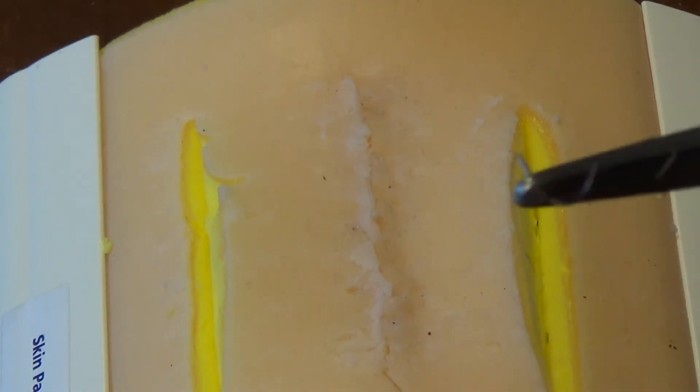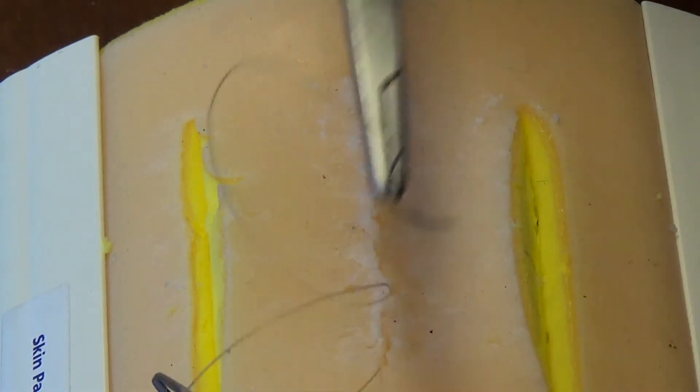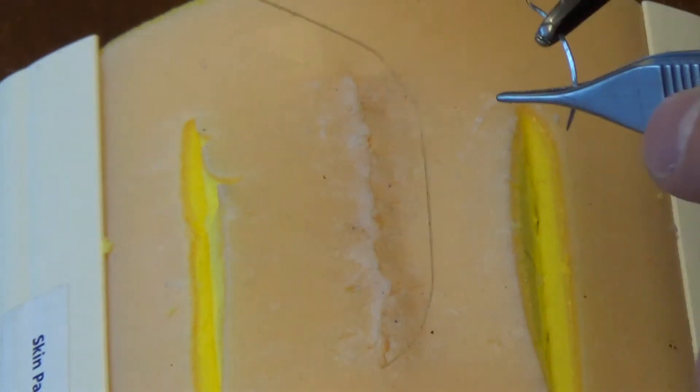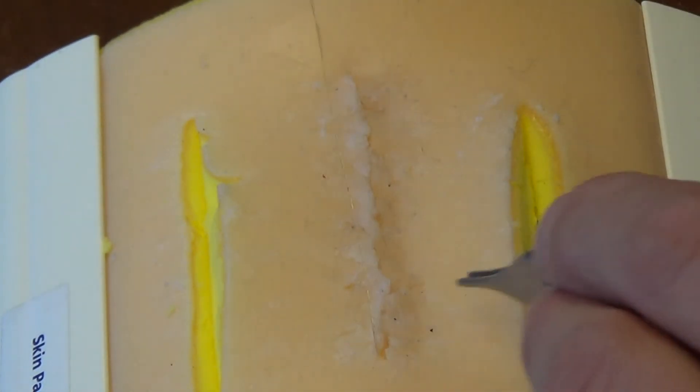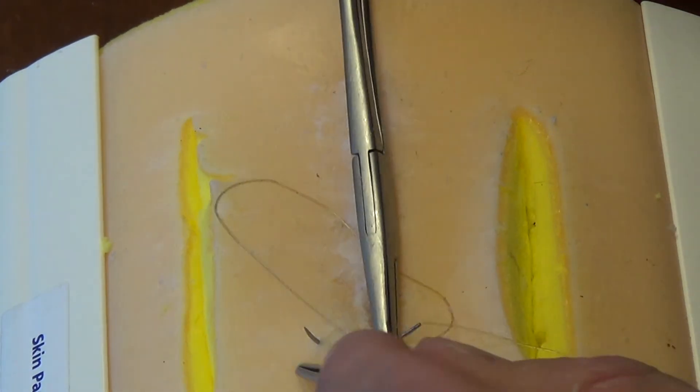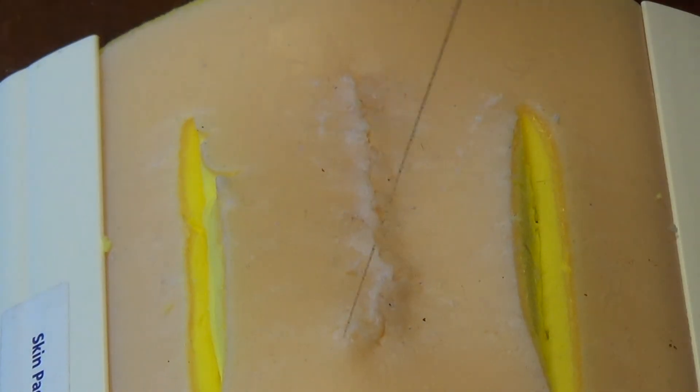So now I've closed at the apex of the incision, and for this layer I'll choose to backstitch coming out perpendicular to the incision, it doesn't matter what side, pull that in, put the amount of tension, pull up a little bit, cut flush.